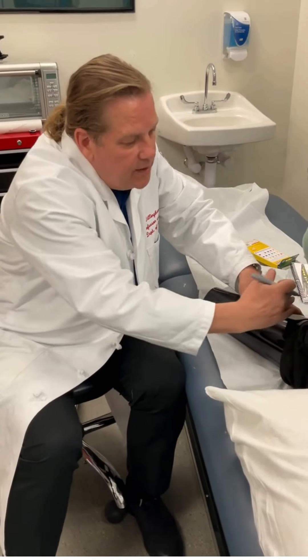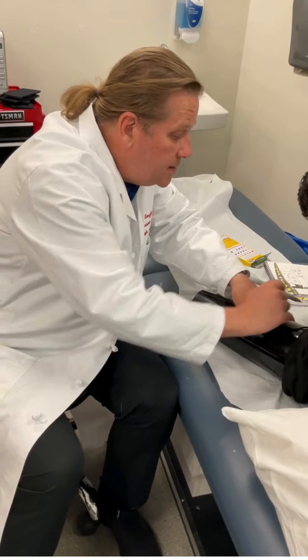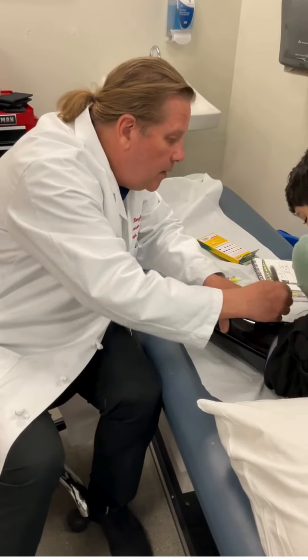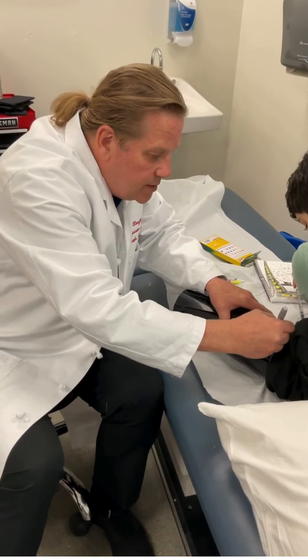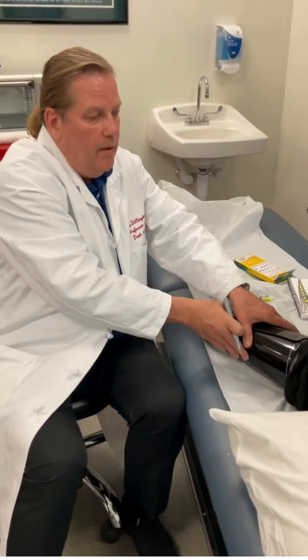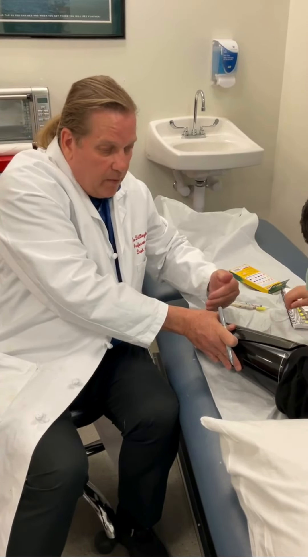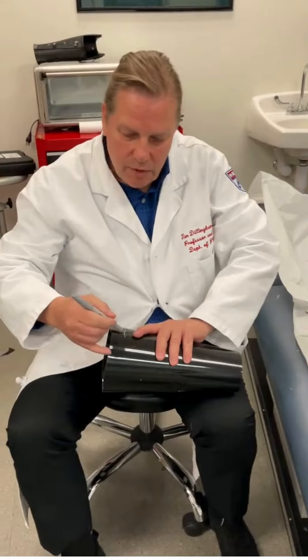I'm also going to have this higher on the outside than on the inside, so we'll have it just about like that. So I'll cut this end first, and then we'll cut the length second. So I'll take this off and just bring this around.